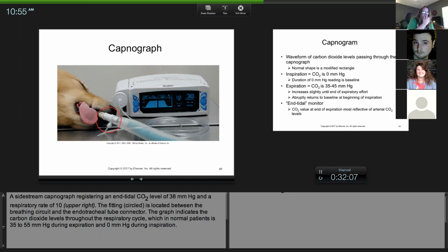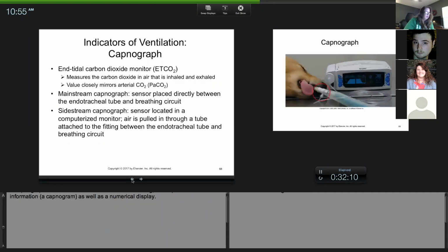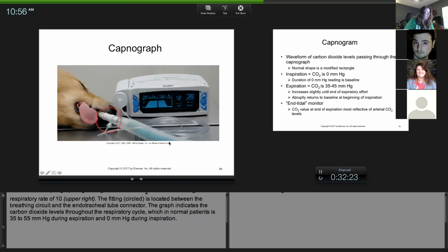That's the monitor itself. Now, it's explaining there's 2 types of capnographs. Side stream is probably the one we use most often. Do you see how here's the adapter and the stream is coming out the side? So what happens is when the animal exhales, a little bit of that exhaled air goes in through this tubing into the monitor. It's going to be sampled every time they inhale and exhale. When the animal inhales, see this breathing tube? This is coming from the anesthetic machine.